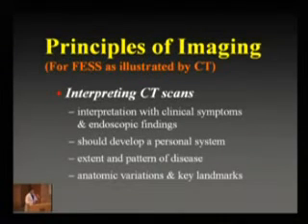Interpretation of the CT. I think in this area, as clinicians like ourselves, we are actually in a better position to interpret the radiograph, the CT scans, than our radiologist friends. And that's why sometimes if we do have these X-ray meetings, so that we can have good communication between us and the radiologist, this will enhance the way it is interpreted. Because after all, we have access to the history and the physical findings, and then we look at the CT, and one step further, we actually operate on the patient, and we know what is happening. And therefore, it is actually much better for us to look at all the CTs.